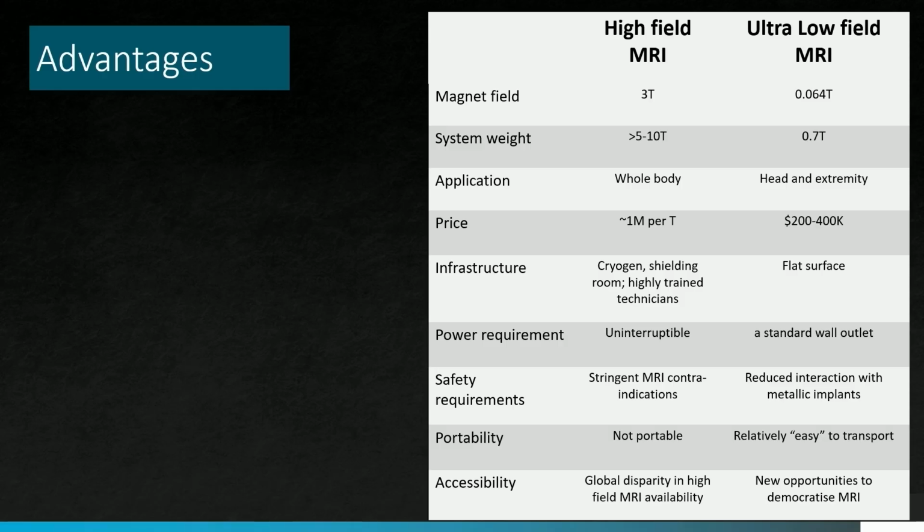The power requirements are, again, a whole issue for high field MRI. I found an amazing comparison from another presenter last year: high field MRI almost requires the power of a submarine, compared to ultra-low field MRI, which you can just run from a standard wall outlet, like for a coffee machine. And I must say, I do prefer my coffee machine to a submarine. As for the safety requirements, as we are all familiar, we need to do a lot of safety screening before we do high field MRI.